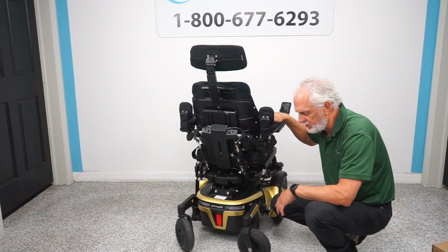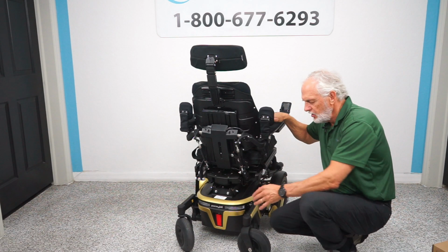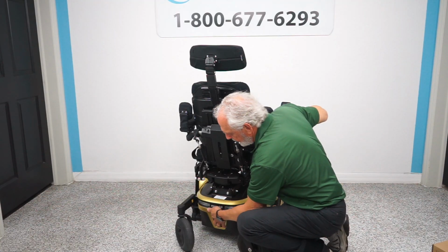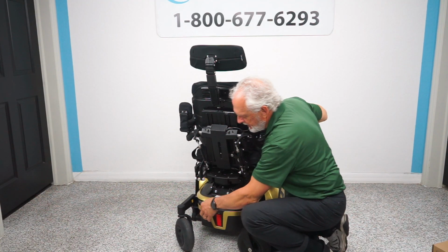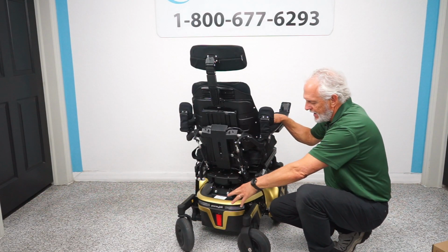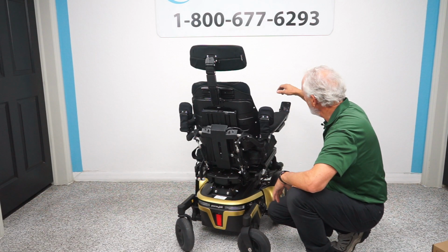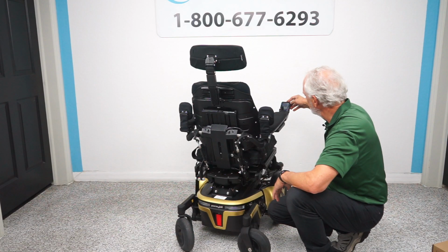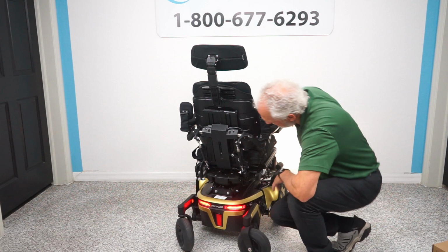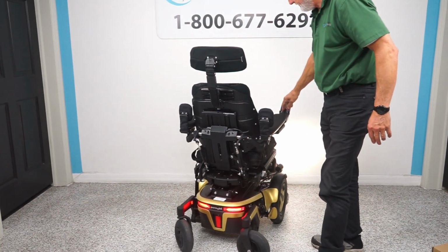When you get this chair, now it is hard to turn on. When you get it, you really have to feel it and then push it back that way. So it is kind of hard. A lot of people tell me, oh, it's broken. It's not broken. It just takes a strong finger. The power's back on, so if I go back here and I turn the power back on, and I can turn my lights back on. Okay? So, and that's that.